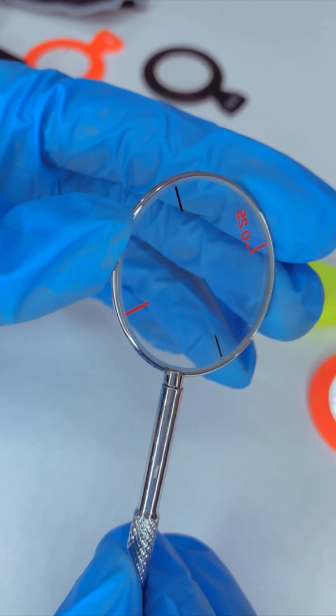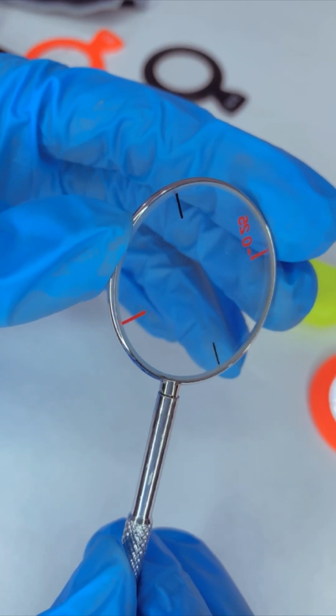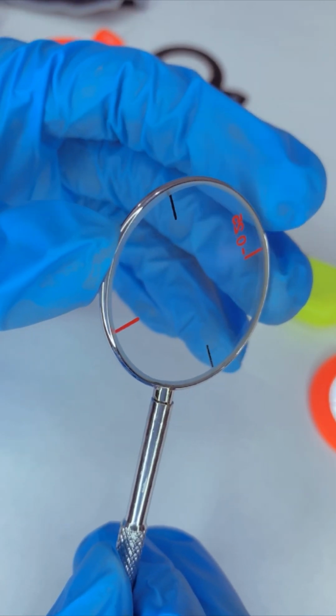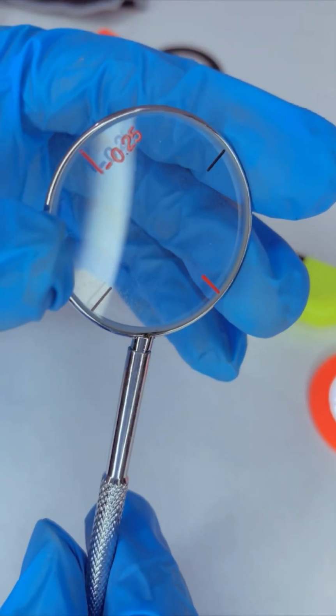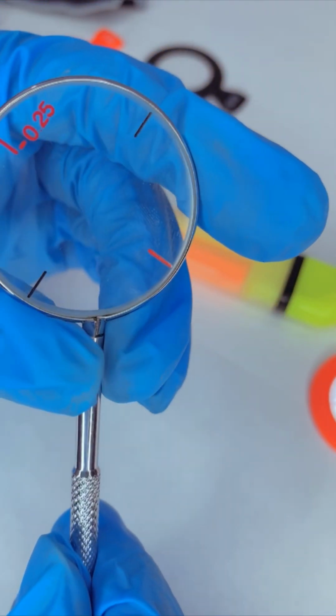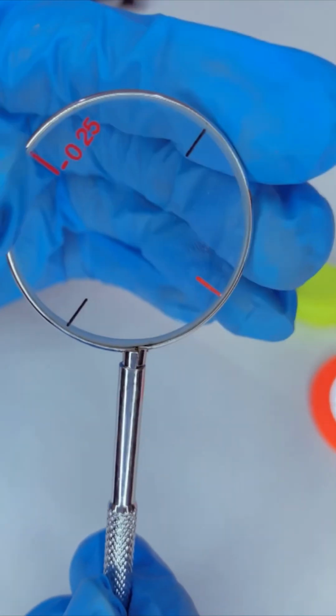Whether to find the axis or to refine the axis, whether to find the power of a cylinder or to refine the power of a cylinder, we use the JCC to do that. And in fact, it can also be used for testing the near point of the eye. That is something to talk about on a different day.